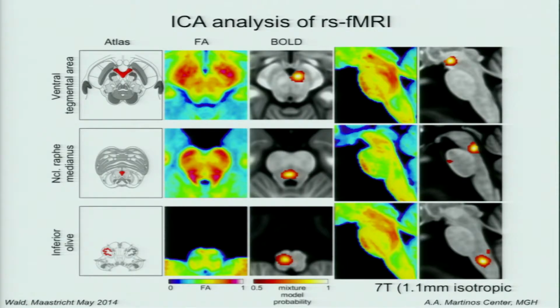So we kept going down the brainstem. This is an ICA analysis shown with some diffusion data, and in this case, it's a masked ICA. Again, the CSF is a culprit, so you have to leave it out and make sure you're blocking it so it's not driving the ICA analysis. In this case, we get about 70 robust loci of resting state activation in the brainstem.